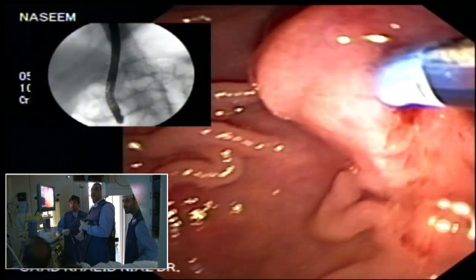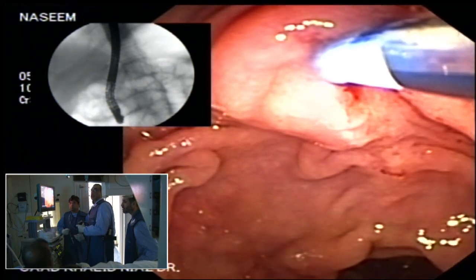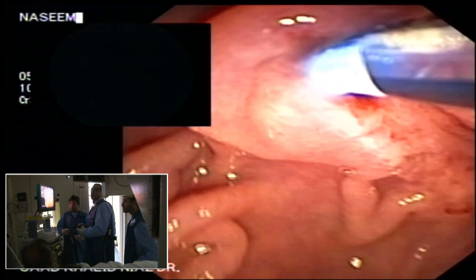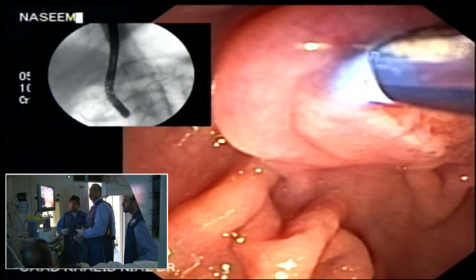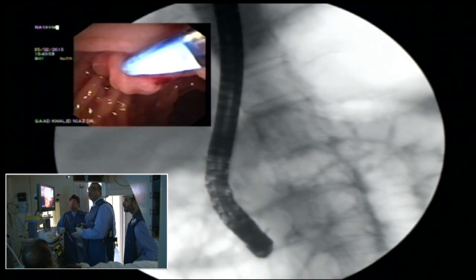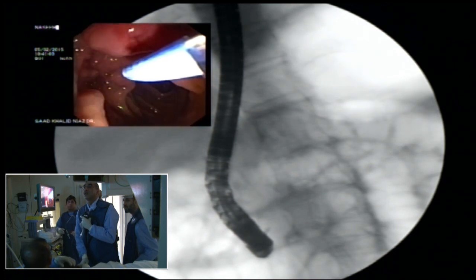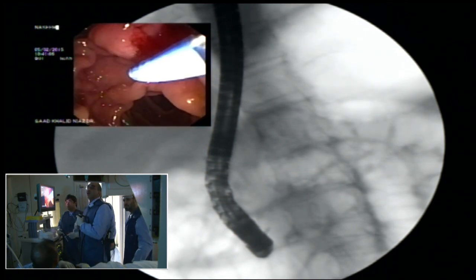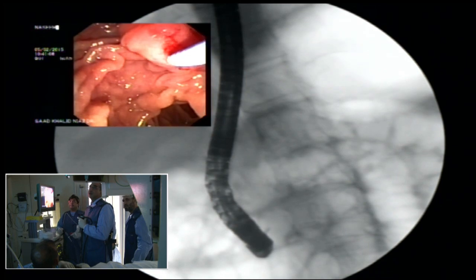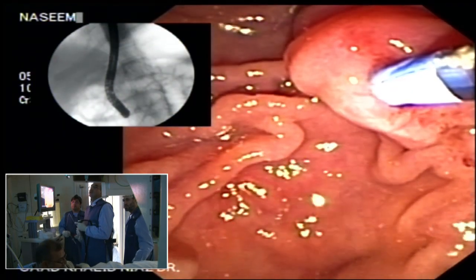Waqar, yeah, there's a query here. Khalid wants to know, if you've now got, it's a difficult cannulation, you've finally got into the pancreatic duct. In your practice, do you normally put a pancreatic stent at this stage and then proceed, or you don't? Not necessarily, unless I'm going repeatedly into it. Because you can cause a false passage, and then you do a one-off, I wouldn't really.